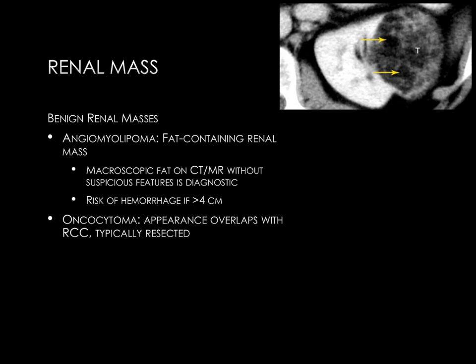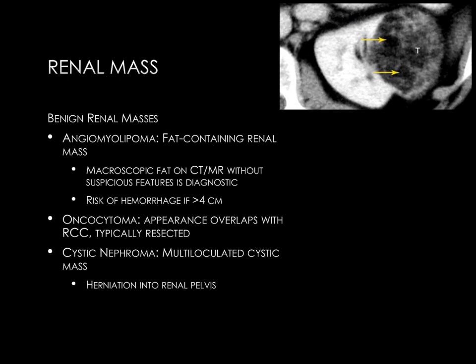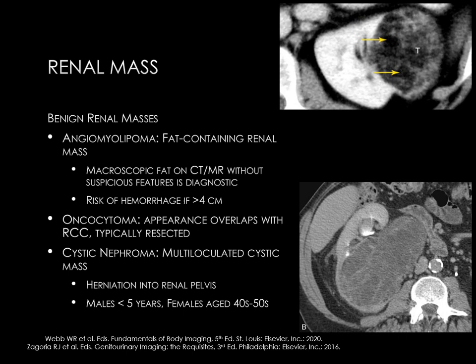Renal oncocytoma is a benign solid renal mass whose appearance typically overlaps with RCC. For this reason they are typically resected, as imaging cannot reliably differentiate oncocytoma from RCC in many cases. Cystic nephroma is a multi-loculated cystic mass which classically demonstrates herniation into the renal pelvis. This occurs in young males and middle-aged females. The CT image demonstrates this multi-septated renal mass herniating into the renal pelvis, classic for cystic nephroma.